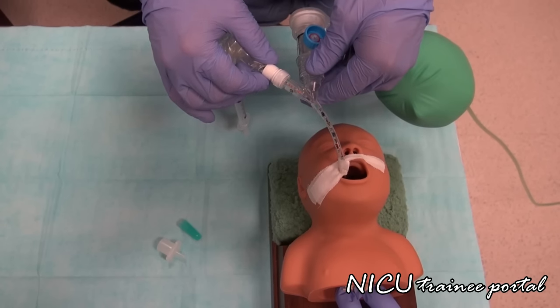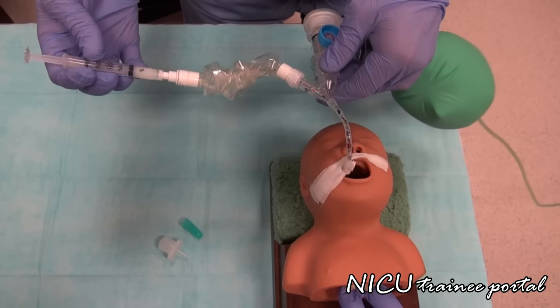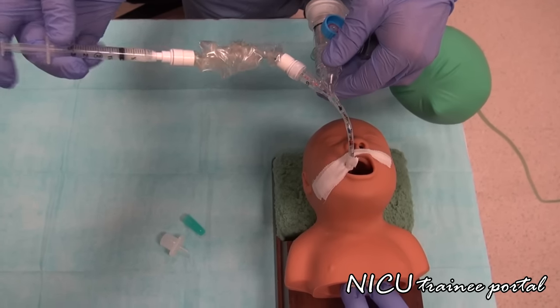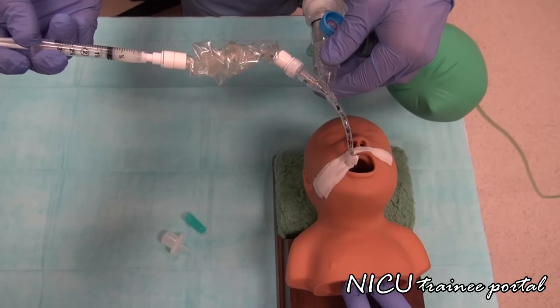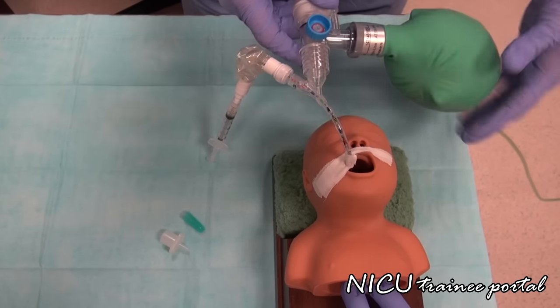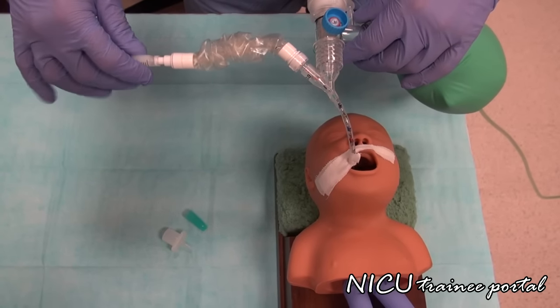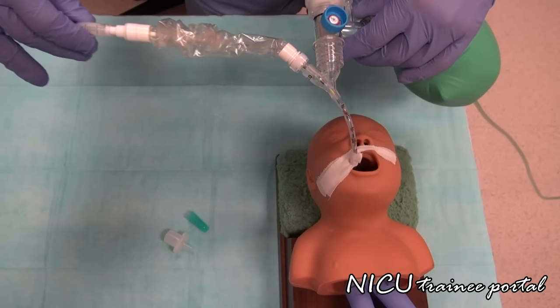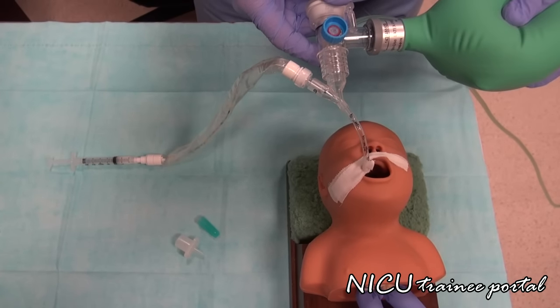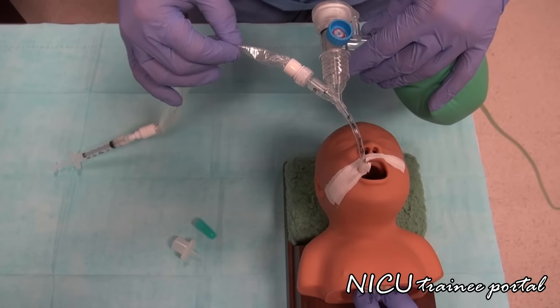From there, we will take our aliquot or our dose of surfactant and administer that over a period of a few seconds, ensuring that the surfactant does not come back up the tube. If it does, we will continue to bag the patient through that procedure. As you finish administering the dose of surfactant, remove the catheter and then resume normal bagging. That's the demonstration of inserting the catheter.